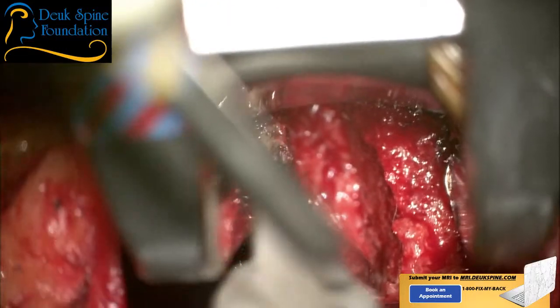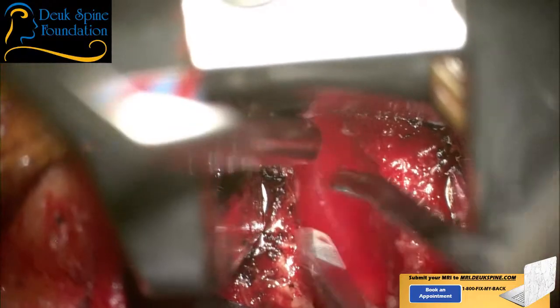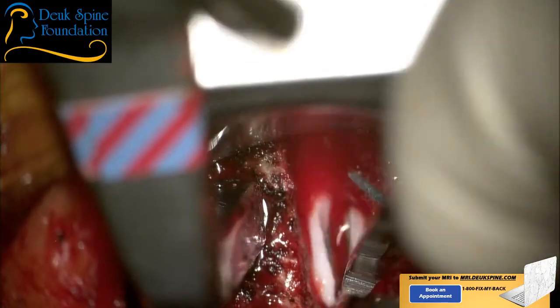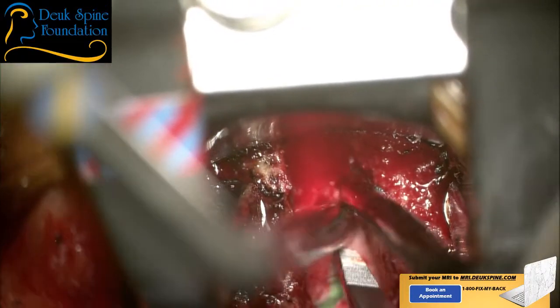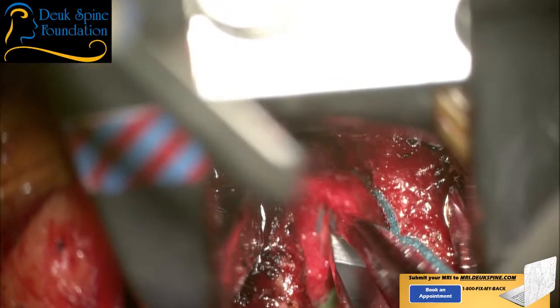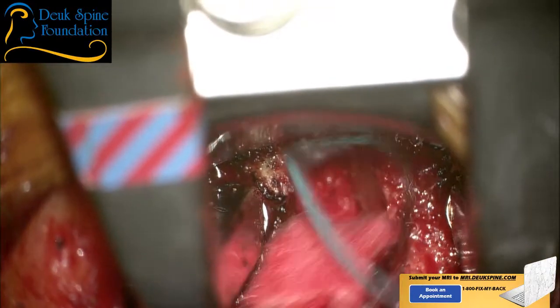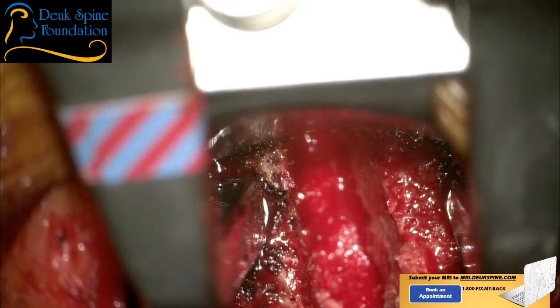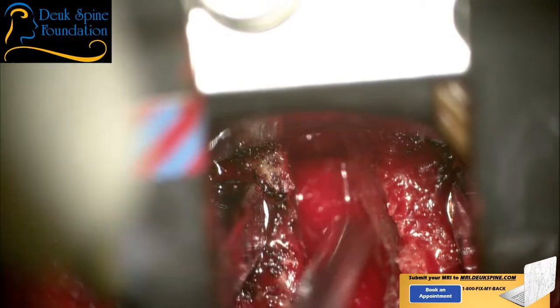All right. So the gel foam is soaked in thrombin, and we're going to just put it in there for a minute. Suck on top of this, please. Gently. Yep. Suck, suck. Get that blood out.